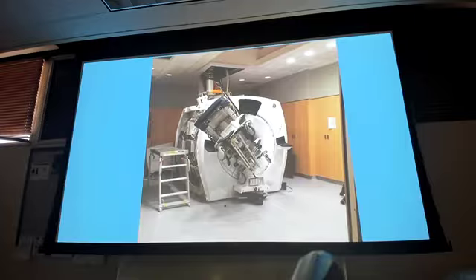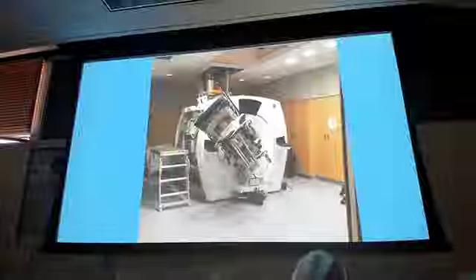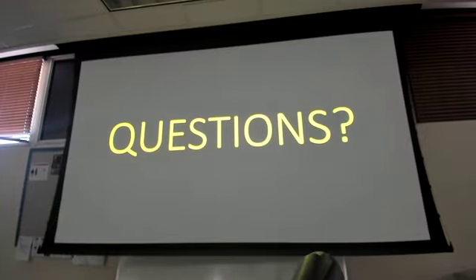Is that going to damage the machine? Oh yeah. Is it pretty non-durable on the outside of it and everything? Yeah, this is just plastic. All this white here, this is just plastic. So that damaged the machine. That's a $3 million mistake. Luckily one you guys won't make because you're not the one running the scanner. But I feel bad for that rad tech. That is not good. Questions on that stuff?